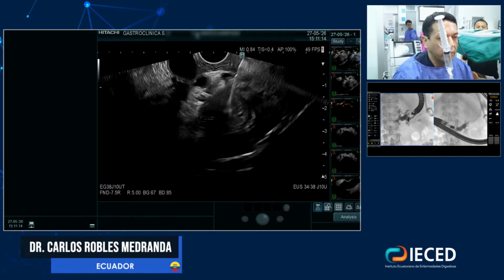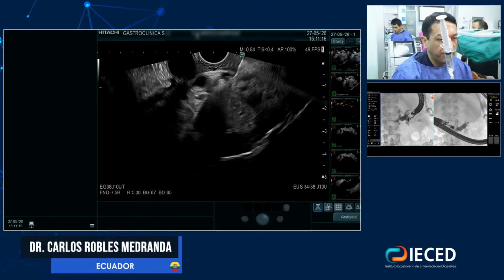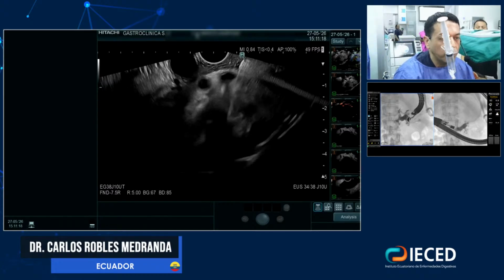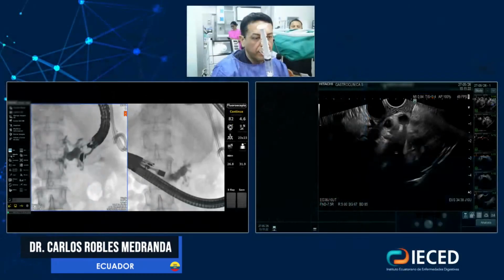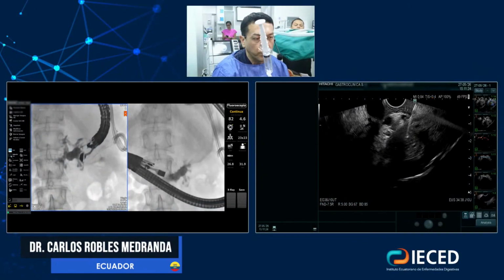But I believe it's not so far. So I will finish here my transmission. I just want to show the EUS. I will continue working here, and then if I have time I will try to show the results.